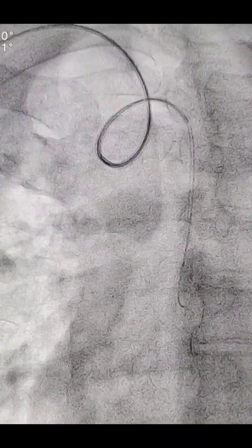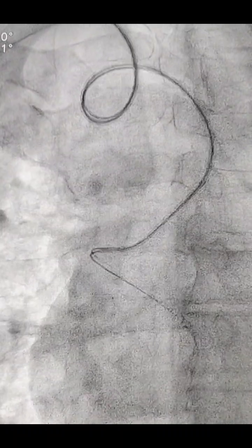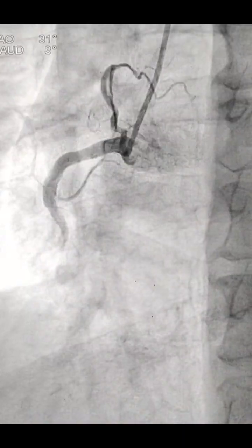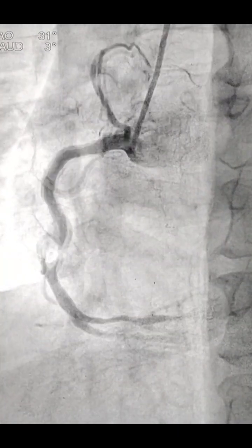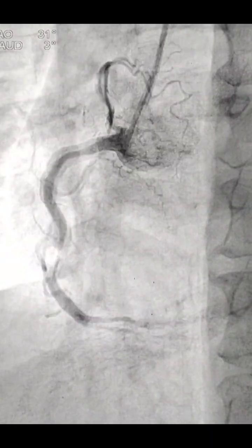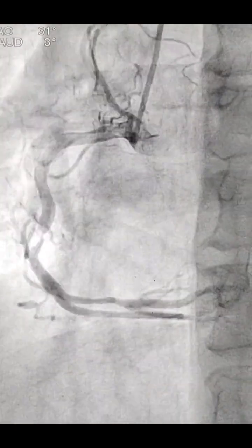And this is the roller coaster catheter propagation. And the second thing which I want to tell you is, you can see the catheter is exactly, during the angio, in the conus artery. So in such a situation, the patient may get VT and all.